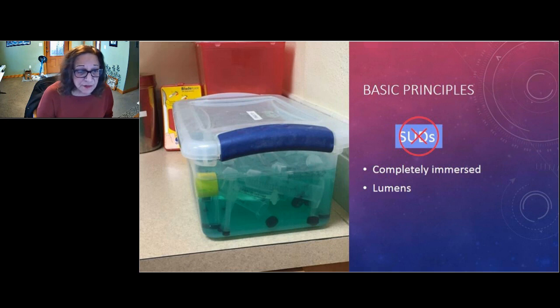You'll also notice what's in this bin are a lot of syringes and some other items, which you'll get a better view of very shortly. Those are single-use devices. Single-use devices should never, ever, ever be reprocessed, whether it's cold chemical sterilization, high-level disinfection, or sterilization. If the package says it is meant for one patient, one use, or single use, then you must dispose of it after you use it once.